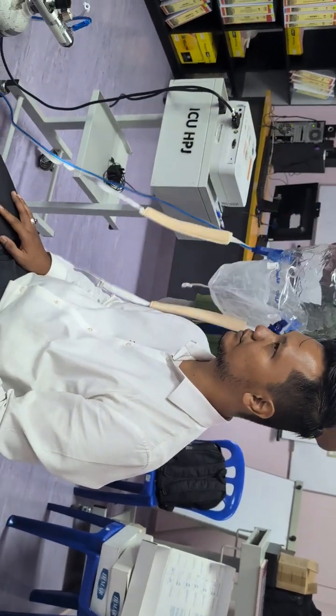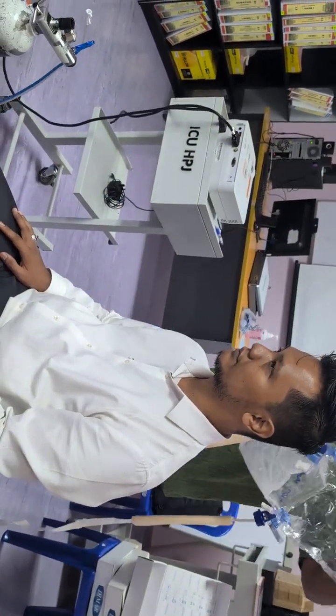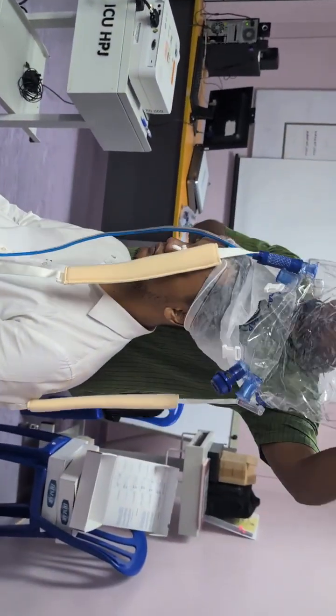Dulu, the helmet requires 2 persons. Sekarang, the helmet requires 1 person to pasang.